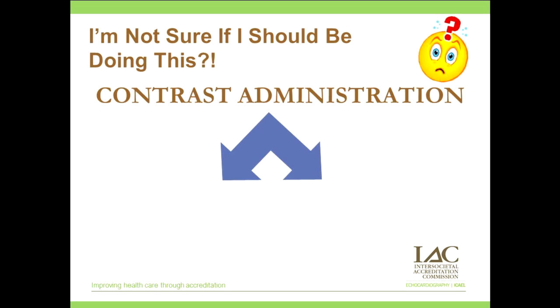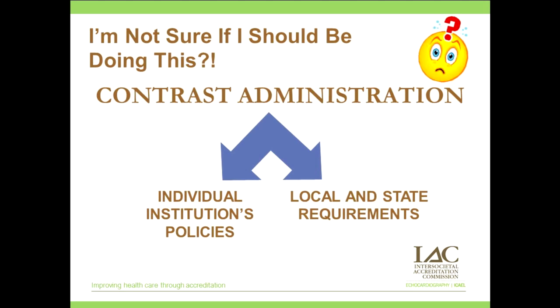Again, you'll need to check with your individual institution's policies and your local and state requirements. But what's very important is that whomever administers the contrast will need to know the proper techniques to use. They should know the indications and the contraindications, and of course, the potential risk to the patient.